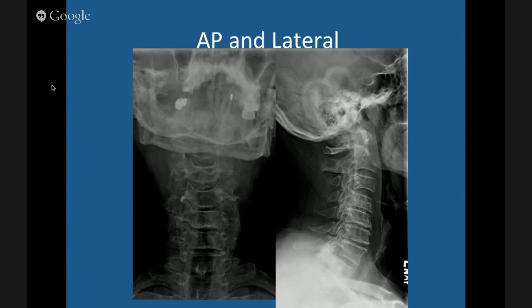On the lateral film, the first thing we always comment on is how many of the cervical vertebrae you can see — C1 through C7. A good C-spine lateral should include T1. That's the arch of C1. That rounded structure is known as the ring of Harris. That circular area is important when looking at trauma patients for fractures of C2, because what will happen is you'll get an interruption of that ring. Then we trace the anterior spinal line, the posterior spinal line, the spinal laminar line, and the posterior pediculum line — though that last one is really difficult unless you have a perfectly straight lateral film.